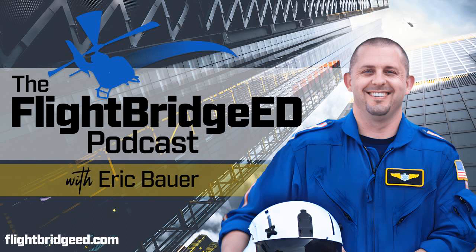And so what I've seen in the past, especially from new flight crew members that are utilizing the ventilator for the first time, is they try to maintain that number right in the middle there. And they do whatever they can to do that. Well, there's problems to that. You've got to look at the big picture. You've got to look at everything that the patient's going through as far as their pathophysiology. Look at their ventilator settings. You look at their blood pressure, their hemodynamic status.